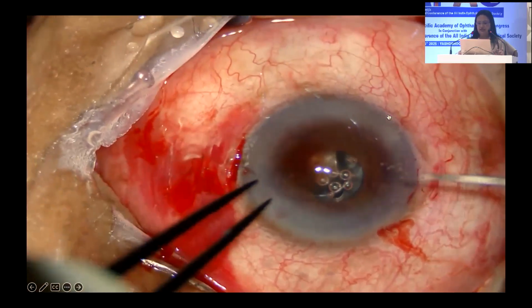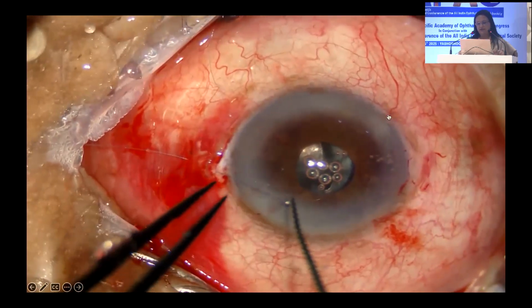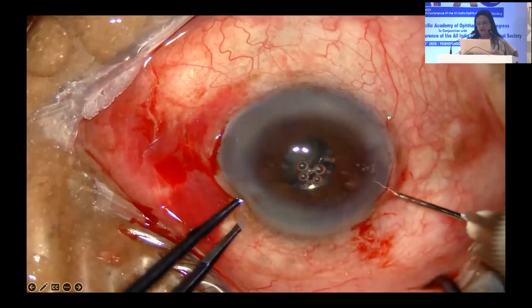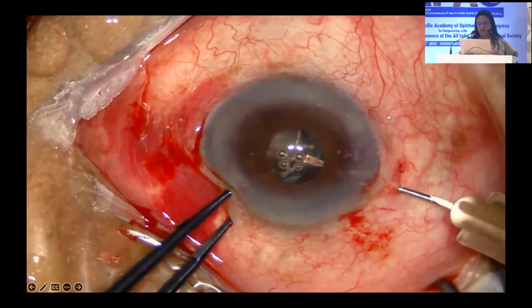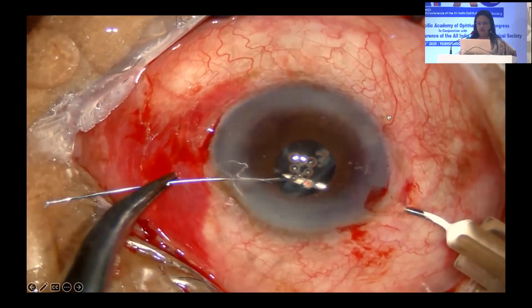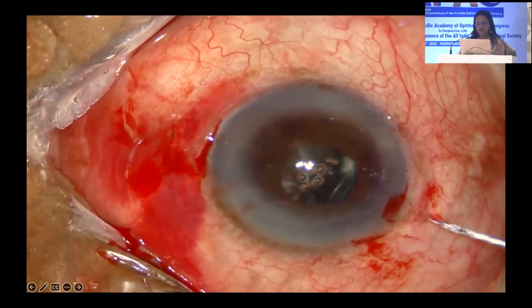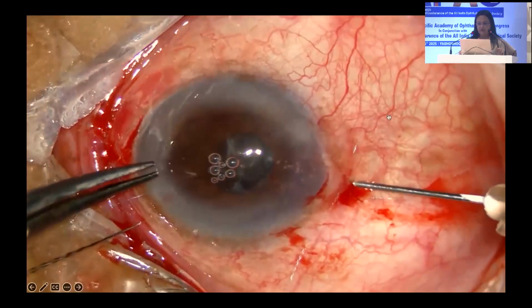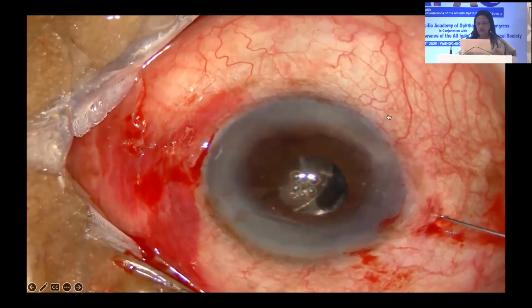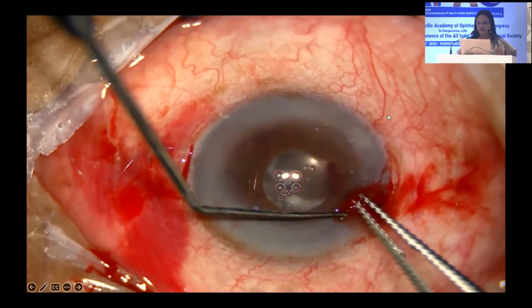You can tie it at a later date. So now you can come to the other end of the haptic. Here, you can see again, this is going at the bottom. You have to do exactly the reverse of what you did on the other side. That is, if you put on top first, then this one comes at the bottom. So again, the next one is going on top of the haptic, and it's railroaded, and now you have a loop around the haptic on both sides, which is exteriorized.